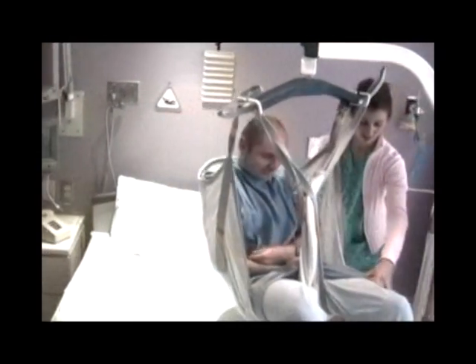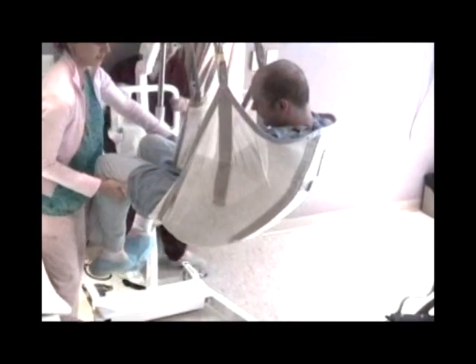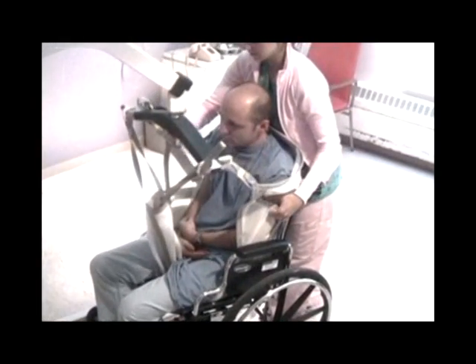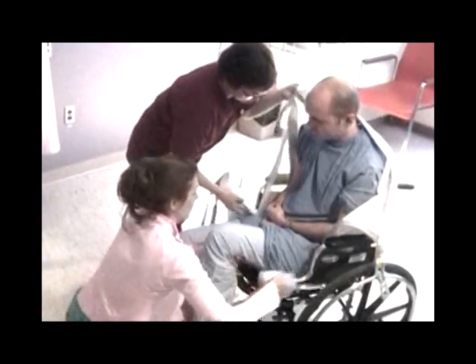The second caregiver should grasp the patient's legs and guide the patient. Turn the lift in the direction of the chair with the patient's back towards the chair. Move the chair as close as possible to the lift and lock the chair brakes. Position the patient over the chair and lower slowly, using the remote hand control, into the chair. The second caregiver will grasp the sling handle at the midline of the patient's back while being lowered, and then guide the patient into the chair. Remove the sling and ask the patient to lean forward to assist in removing.